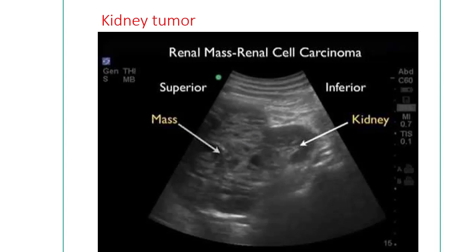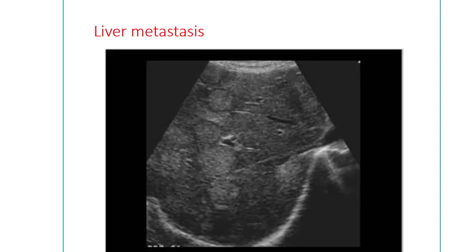This shows liver tumors — there are multiple cannonball-appearance tumors in the liver, most commonly found in liver metastasis.